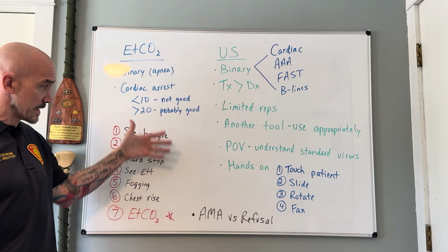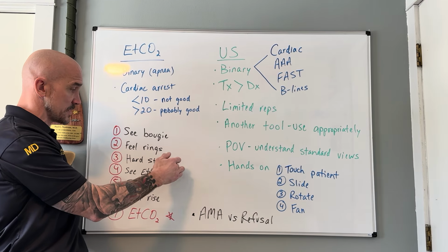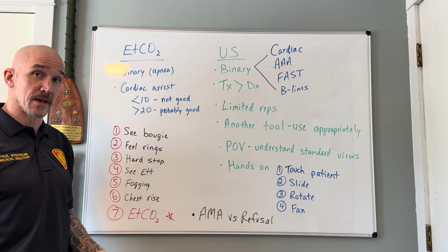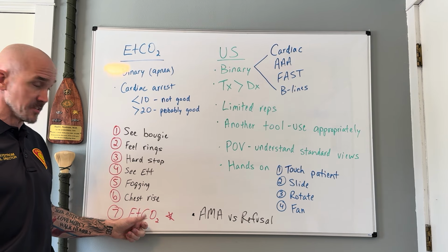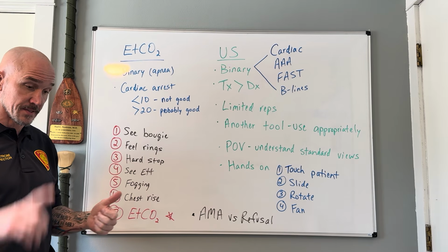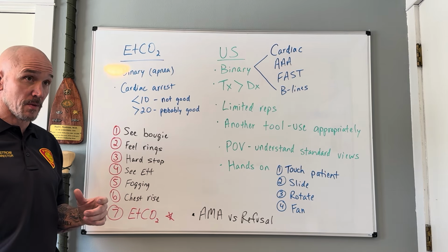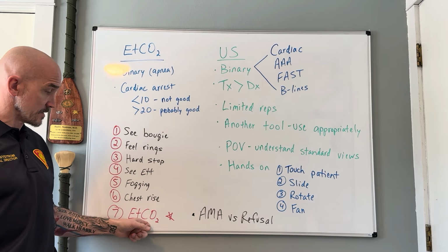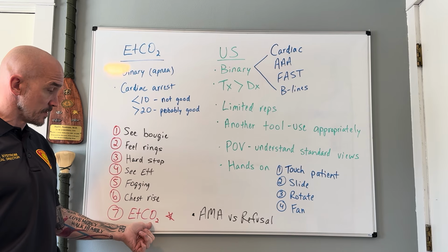We want to, if we're not in the airway, we want to know it as soon as possible. So each of these things is a potential step to know that we're not in the airway and make corrections as soon as possible. The end game though is end-tidal CO2, right? You want that on the stack already, have it ready to be already plugged into your monitor, so you're getting that immediately. That's the gold standard. AHA supports that. With every intubation, we should be doing end-tidal CO2.